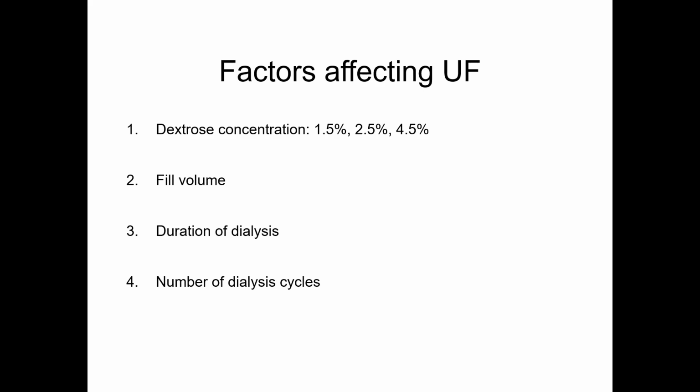Second, if we increase the fill volume of the peritoneal dialysis fluid, it will increase fluid removal. Also, if the duration of total dialysis is increased, this will cause increased fluid removal. Ultrafiltration also increases if we increase the number of dialysis cycles.